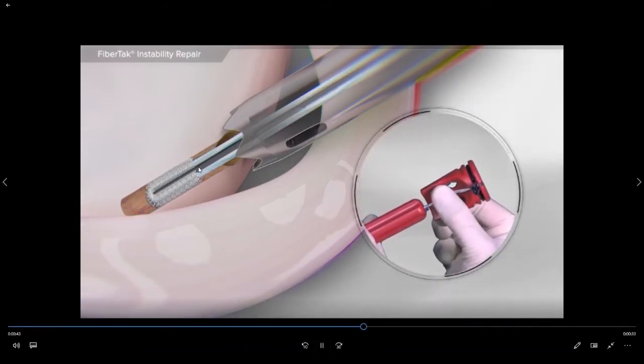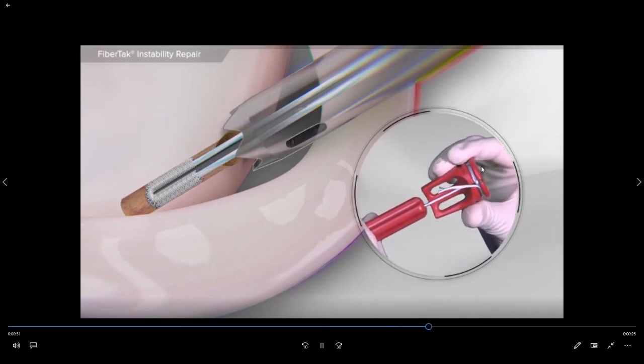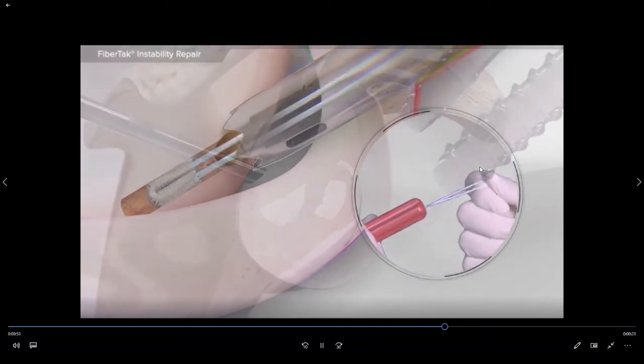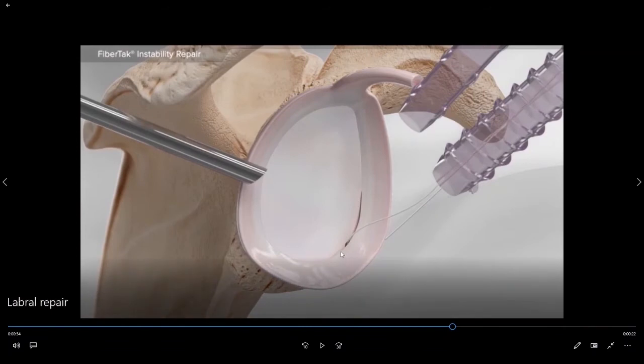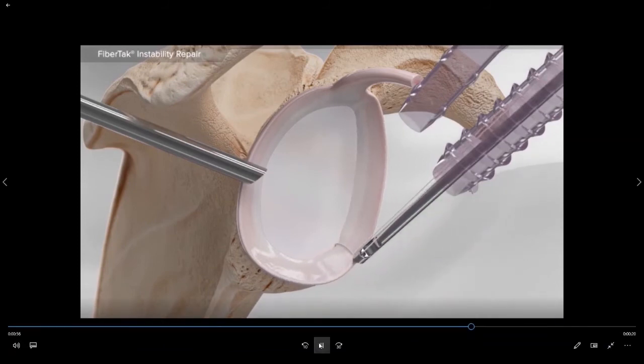Once the implant is in we set it by pulling it backwards. We then simply remove a rubber grommet that holds the sutures and then remove the insertion device. From here we pass a single limb of the suture up and around the adjacent labral tissue and then simply tie the tissue down to the bone.